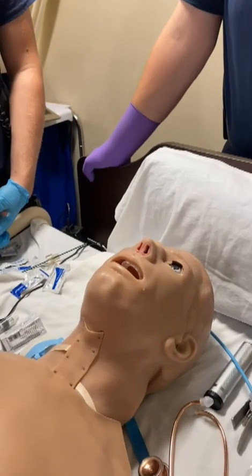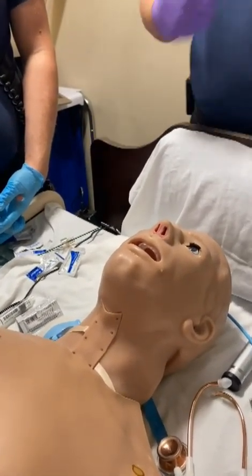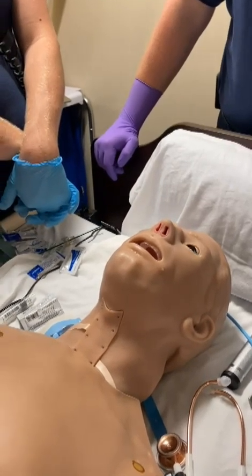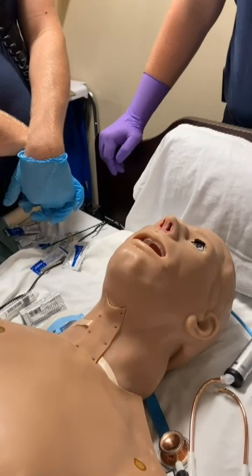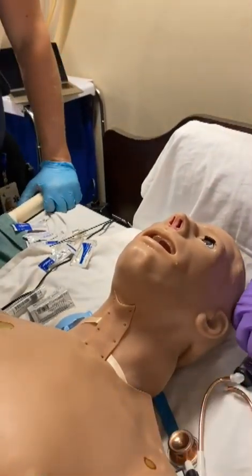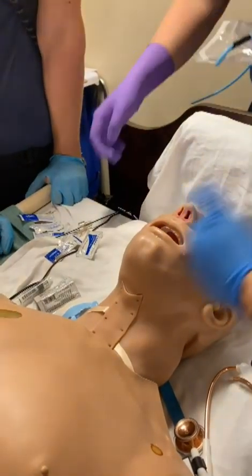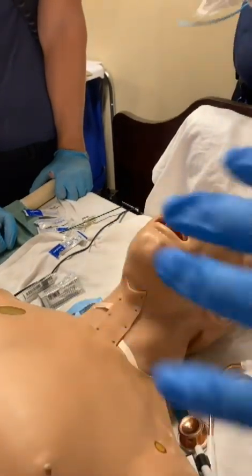We'd be pre-oxygenating. That pre-oxygenation process — how long does it last and what's the point? We'd start as soon as we begin breathing for them, really going for it as soon as we set up for intubation — about two minutes. The point is to give them enough time without breathing for two minutes while I intubate, plus nitrogen washout. We can throw a nasal cannula on here — pre-oxygenating this patient because at some point we move off the BVM and intubate. In that time, he's passively getting oxygen and completing oxygenation plus nitrogen washout — takes about three minutes.